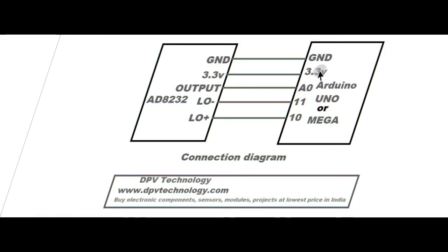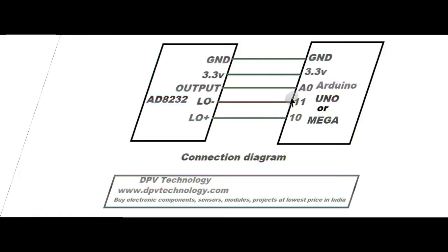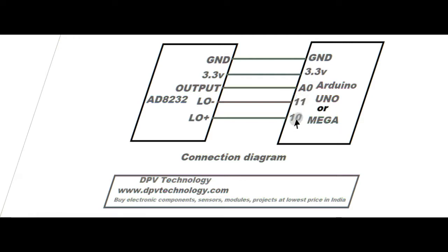Then output pin of the sensor to A0 pin, then LO minus pin to pin number 11, and then LO plus pin to pin number 10. These are the digital pins 10 and 11, and this is the analog pin A0.